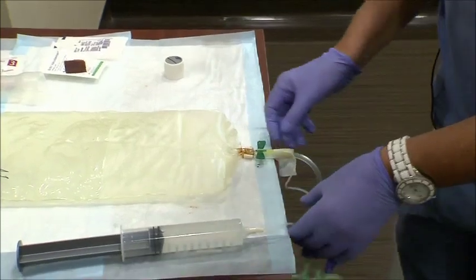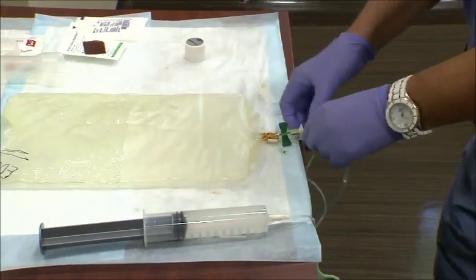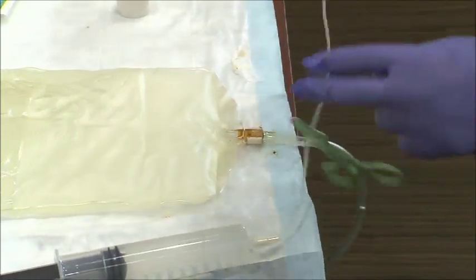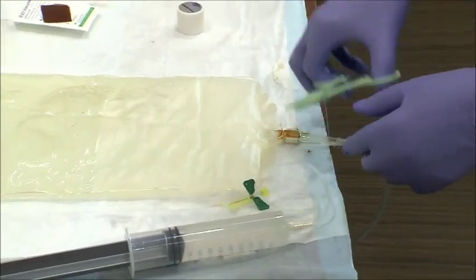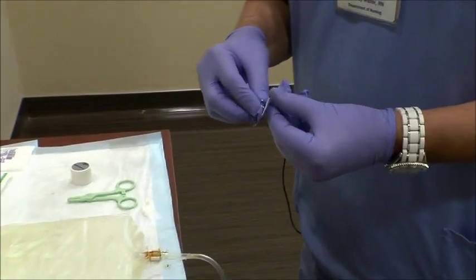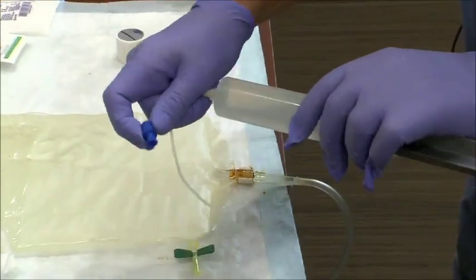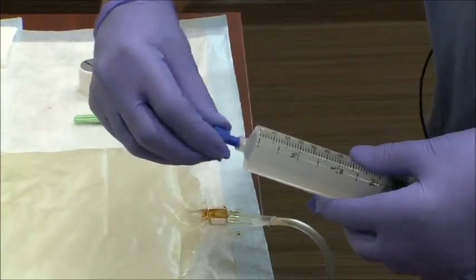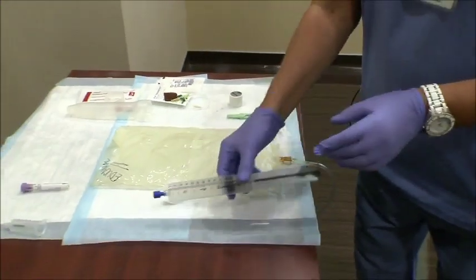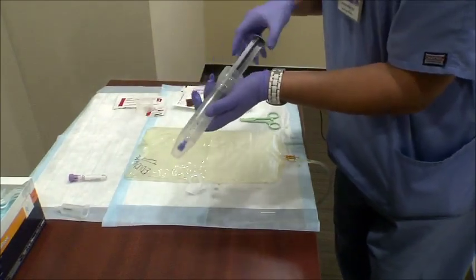I clamp, remove the tape and the needle, we get a sterile cap. Place that on the end. We discard this in our sharps container. We then replace this back into the container.